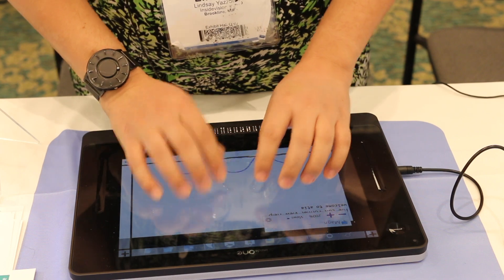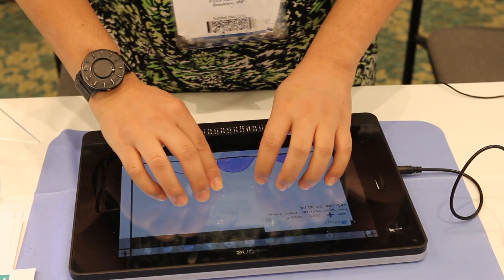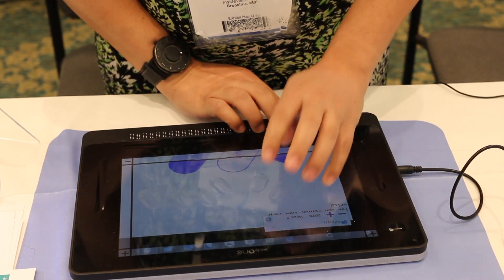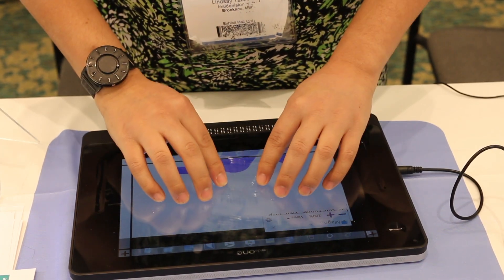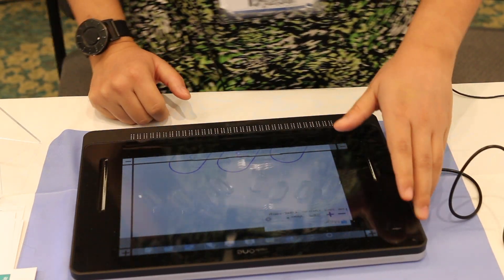I can write whatever I want. But what's also cool about this device is not only does it have a braille keyboard, it also has a visual keyboard too. So a sighted teacher, a parent, or a colleague can also type, and a blind person can read what they've typed.